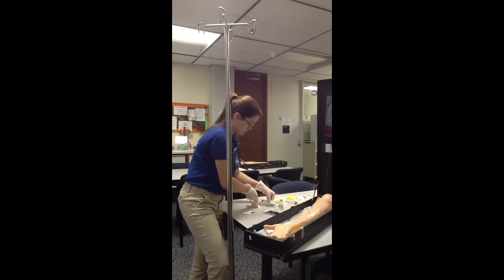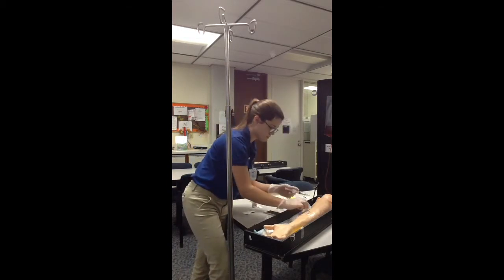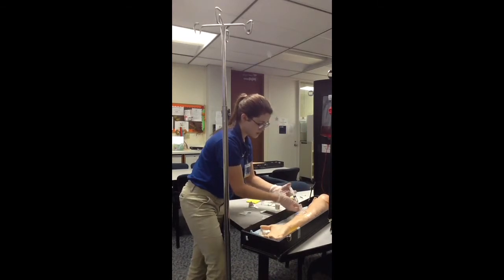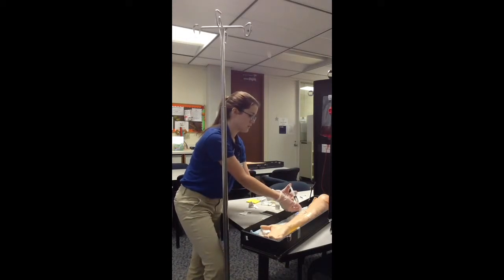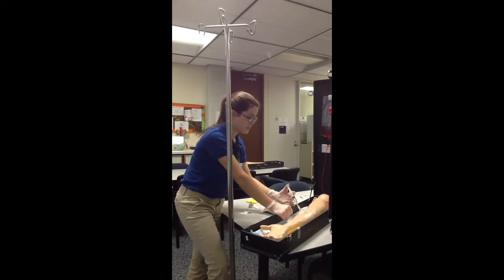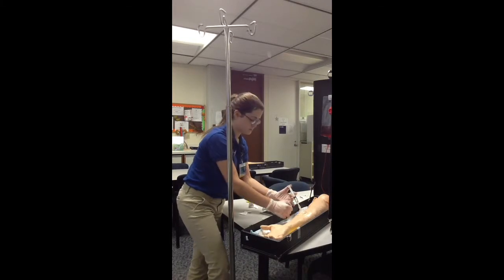Okay. And I'm going to flush your IV. Make sure it's unclamped. And I'm going to flush using the ASASH procedure, which is administer saline, aspirate, administer saline, heparin. And the heparin would only be used if an order was written for a dose of heparin to flush a central line or a PICC line.